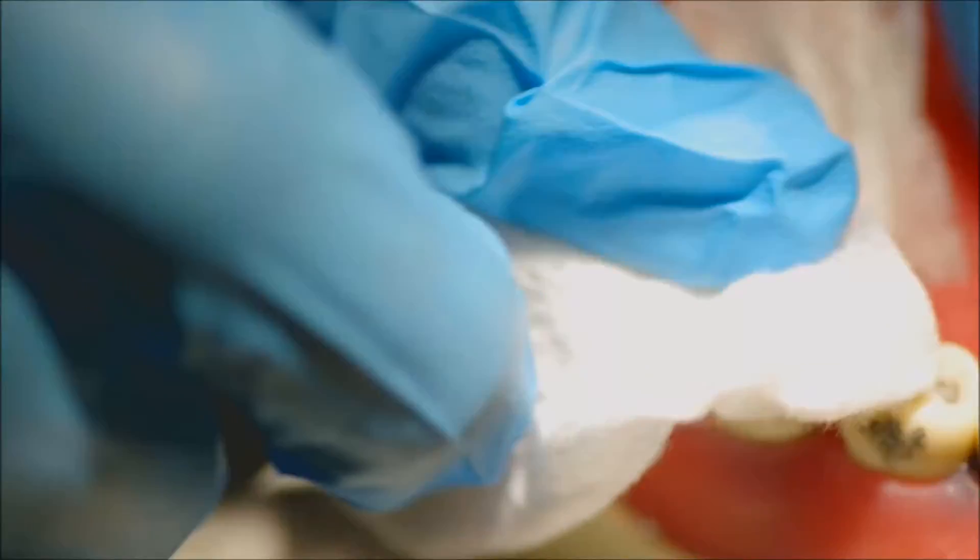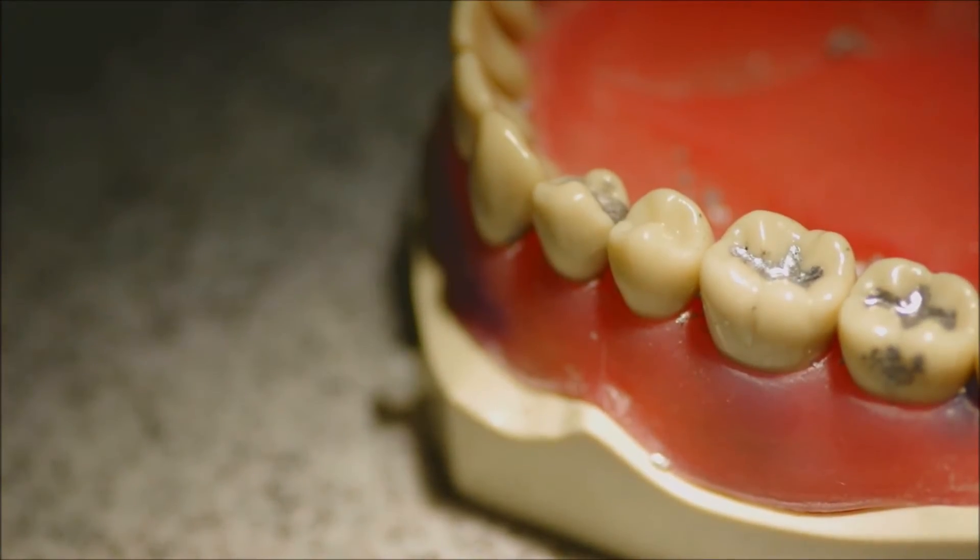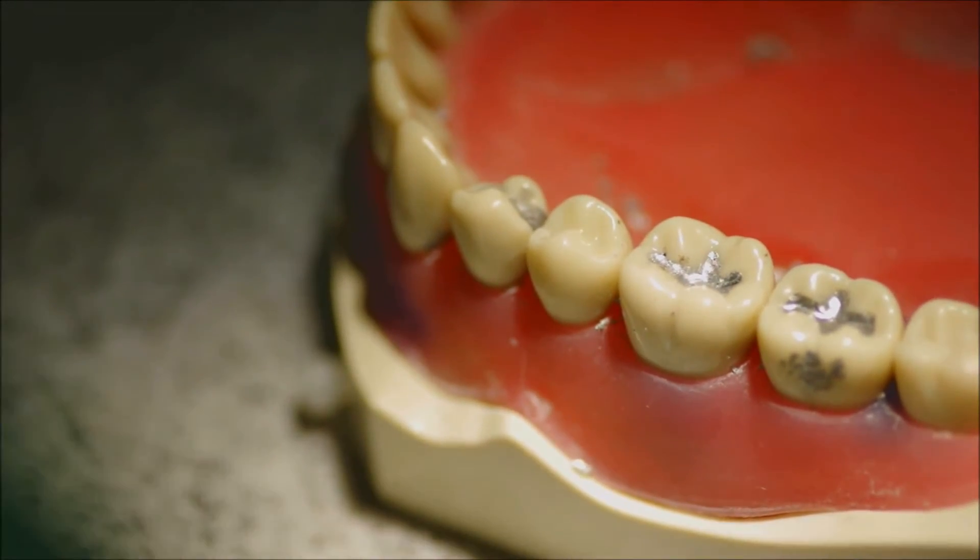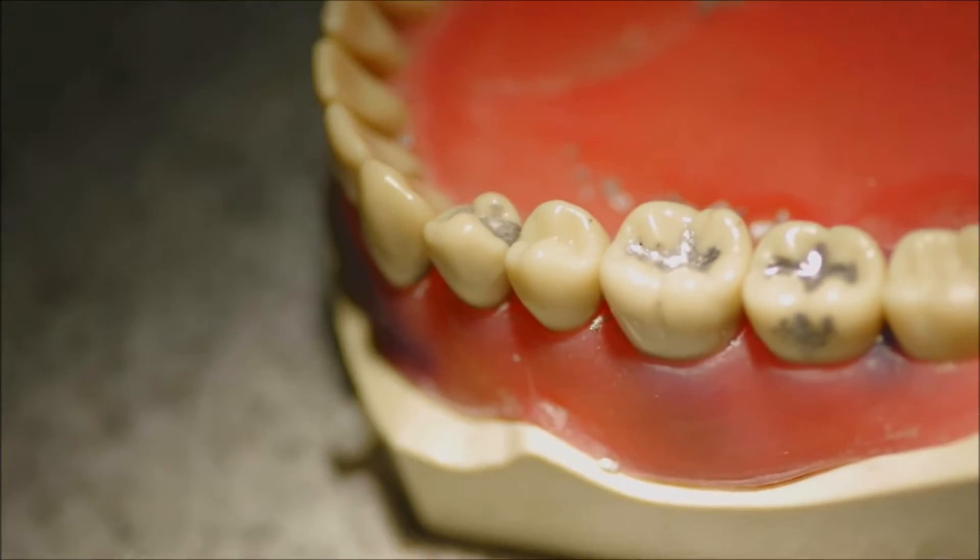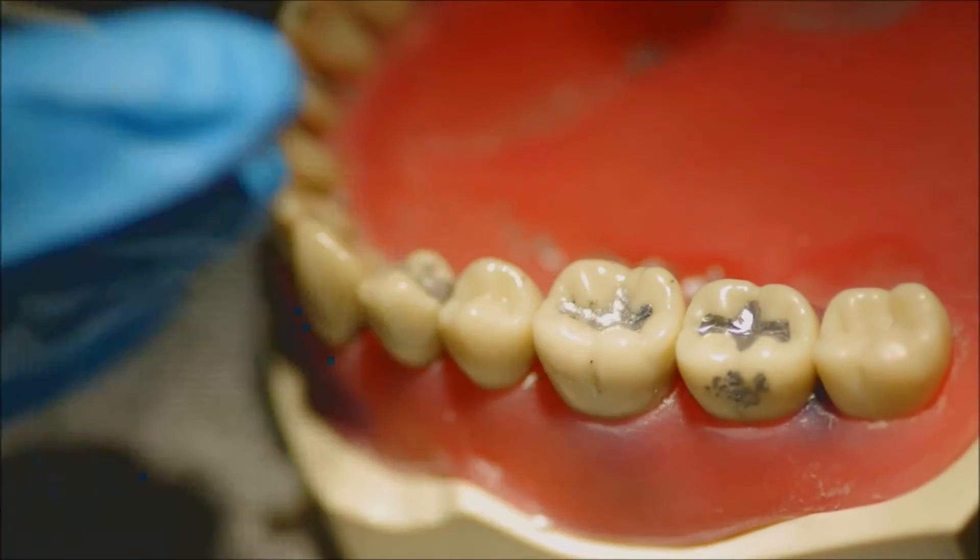This will cause you to lose some of the anatomy that you just created with the acorn. Some of the sharpness of those grooves will be lost because the ball burnisher will push things back into the groove you just created. But you want to do this in multiple steps to ensure that you have a smooth finish with sharp defined anatomy.